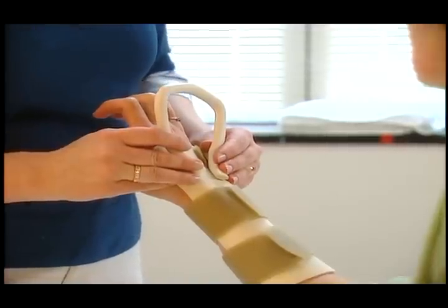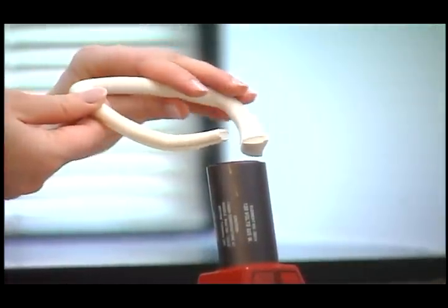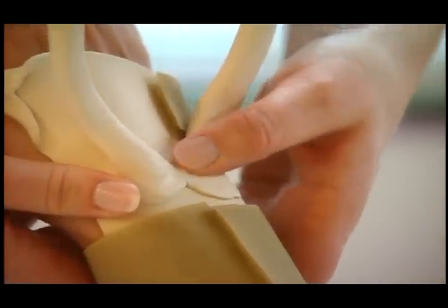After the custom outrigger is cooled, it can be attached to the splint base. It is best to prepare the surface of the splint and the outrigger by scoring or applying solvent and heating the surfaces with a heat gun. Once heated, press the surfaces together in the position desired and hold them briefly to ensure adequate bonding.